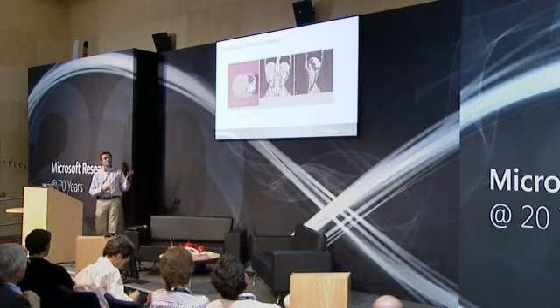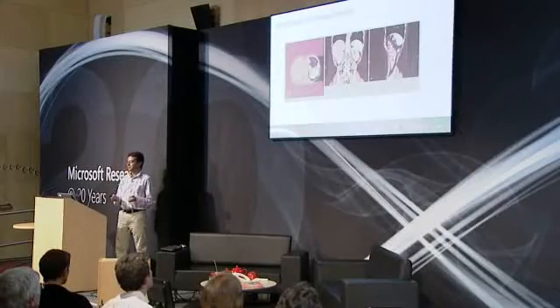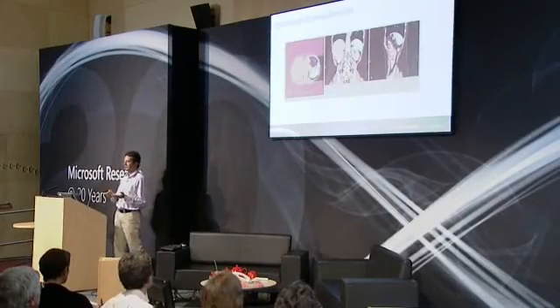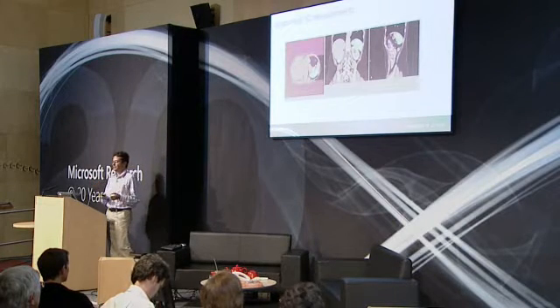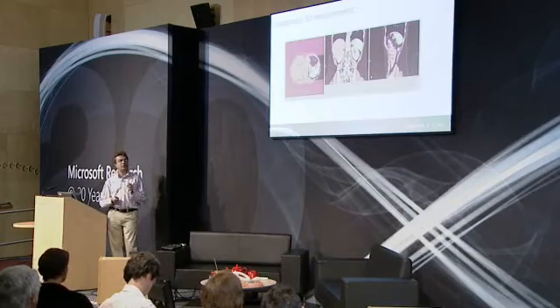Now that we have this information, I can measure the volume, for instance, of that organ. I can straight away say not only that the spleen is larger than it should be, which is a well-known possible condition, but also exactly how much bigger it is than average, for instance, or whether it has grown or shrunk with respect to the previous month, and exactly by how much. Right now, it's all done by eyeballing. Oh, it looks like it's growing, it looks a bit different, but how much? So quantifying visual information is a very, very important and difficult task.